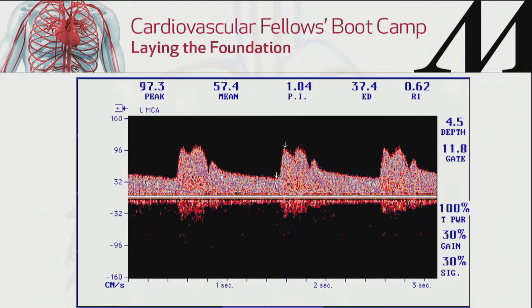The waveform gives you really beautiful information about blood flow. You notice the systolic upstroke has a little dip — that V. That is your vessel compliance; that's why you have a little bit of muscle in the wall. So you're reaching systolic peak and you are met with resistance. When your systolic peak reaches the resistance, you can't increase the speed anymore — it kind of drops. That's why the vessel dilates a little bit and then pushes again. This tells you it's not chronic hypertension — that's very good vessel compliance and not a rigid vessel.